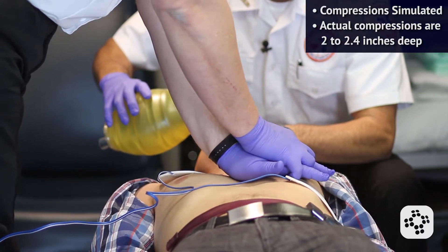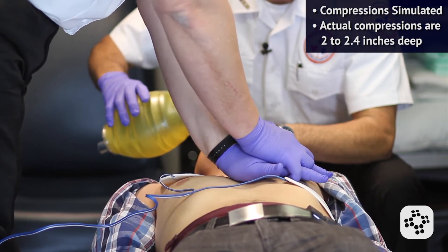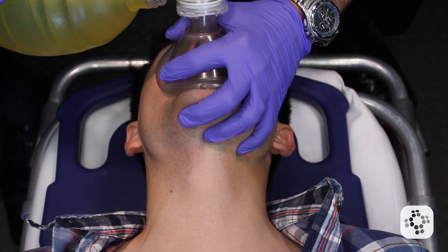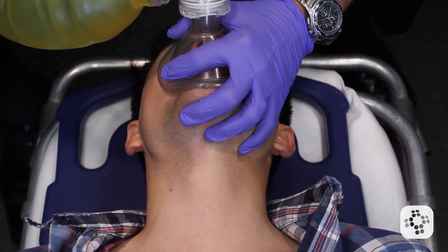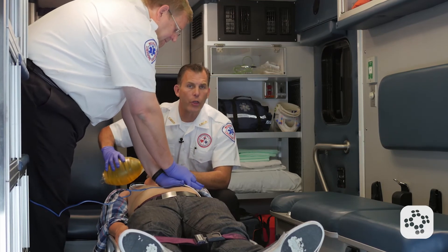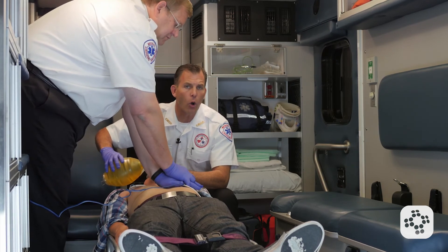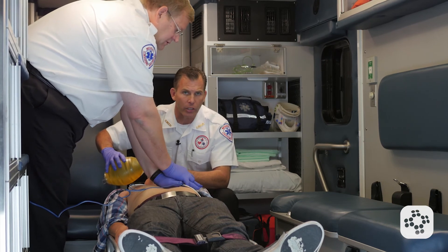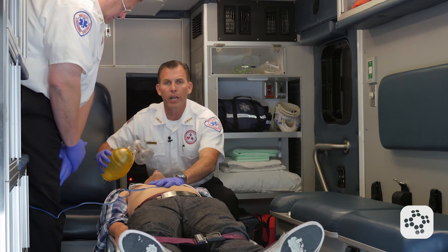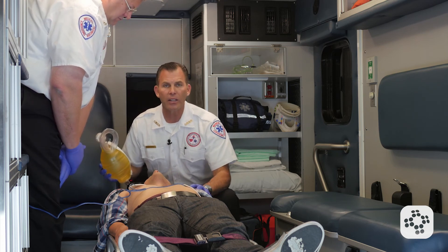Continuing compressions through the count — seven, eight, nine ... up through 30. Breath goes in. Good breath. Breath goes in. Good breath. Then back into compressions — one, two, three, four, five, six. And we're going to continue this 30-to-two CPR every two minutes, switching and coordinating this whole shock, CPR, and rescue breath orchestration of care. It's in minimizing the delay between any action and the next compression that's going to give this circulation of oxygenation the best percentage so that this person has the best chance of survival.